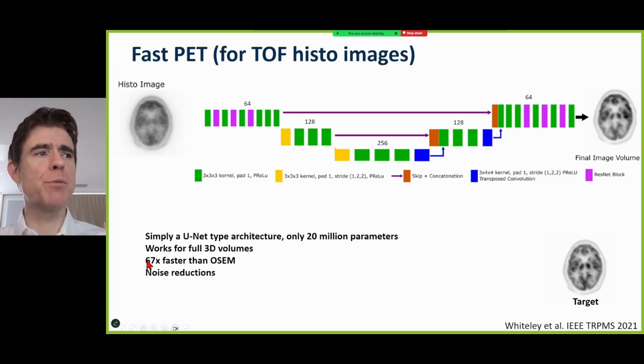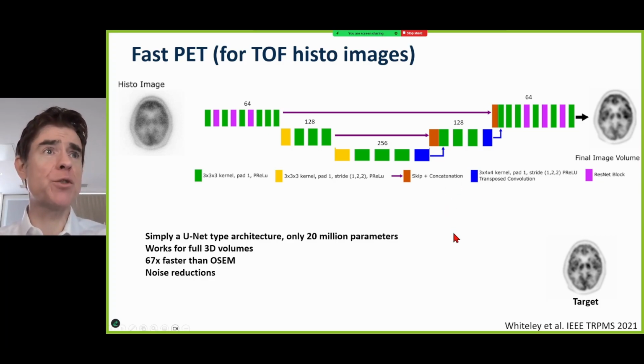And again, this motivation is that they get this massive speed up, and again, only dealing with maybe 20 million trainable parameters, which may sound like a lot of trainable parameters, but of course, as I'll point out later on, if you were to actually look at the number of parameters in even just a matrix going from an image to image, it would normally be many, many more parameters than that. So 20 million is actually already making a lot of assumptions about the kind of mapping from one image to another.